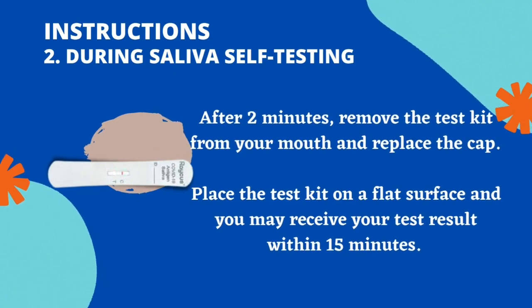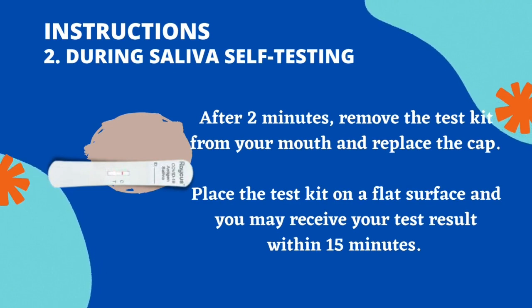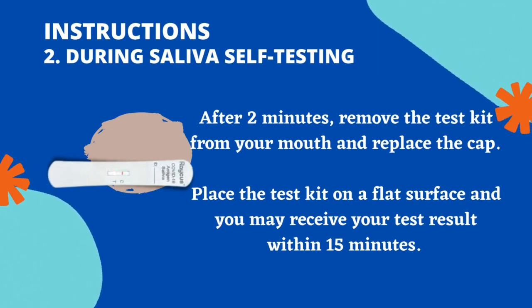After 2 minutes, remove the test kit from your mouth and replace the cap. Place the test kit on a flat surface and you may receive your test result within 15 minutes.